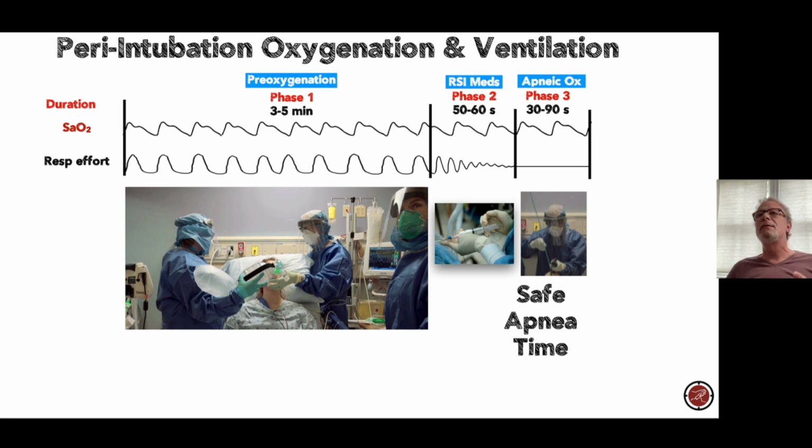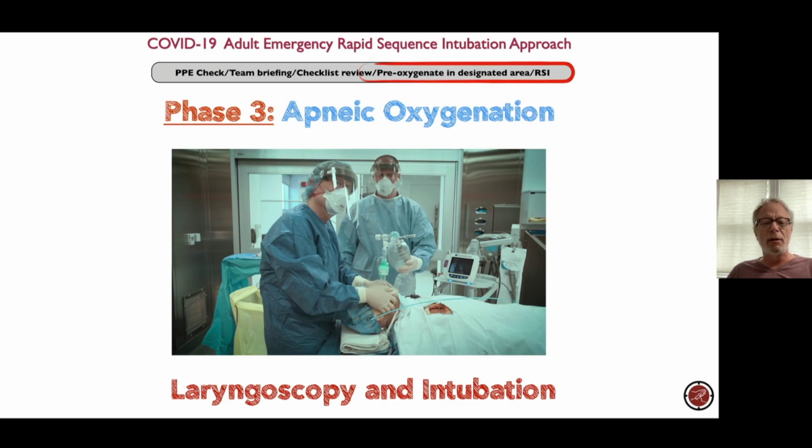But it is reasonable to leave nasal prongs on during that period of time. And what you're doing is replenishing the oxygen. What we have to remember is, as soon as we take the mask off that face, we actually de-recruit. We lose all of that recruitment. So providing additional oxygen and working safely and quickly is important to do during this period of time.